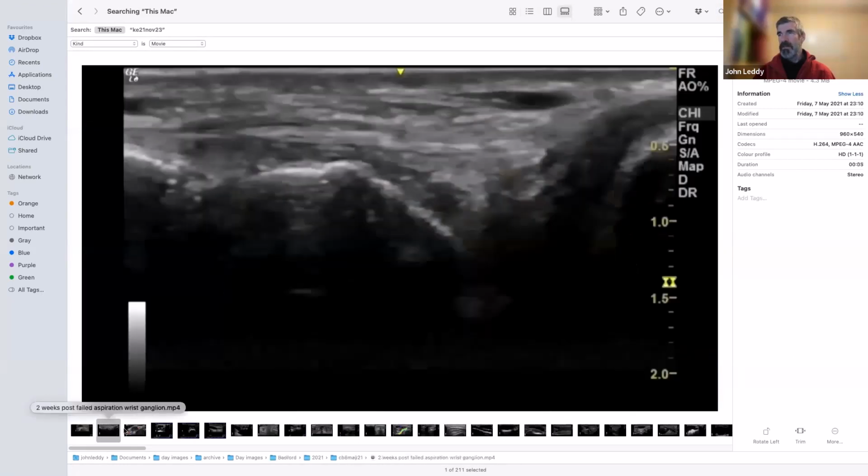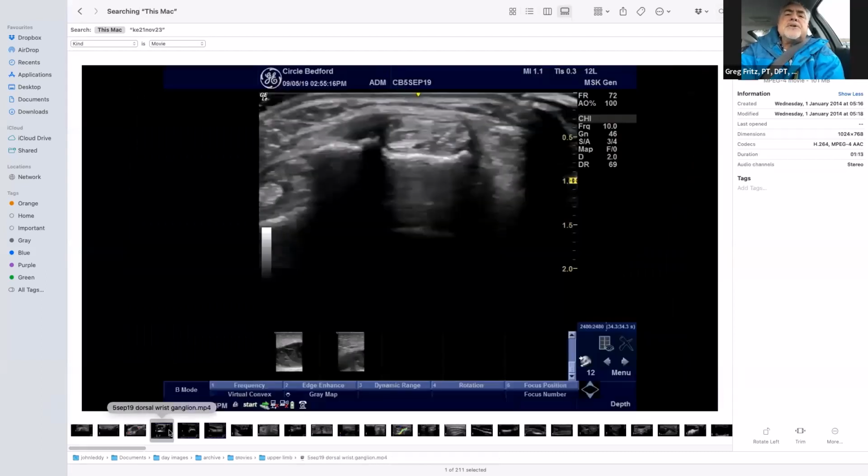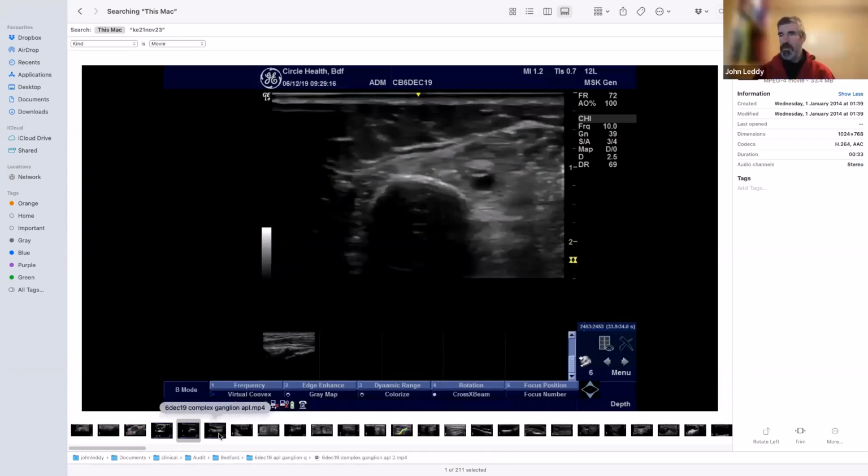Not that video. Let's have a look. Now, you said you would not say that's what it was, but do your images go to somebody who will then call it that? No, they don't.